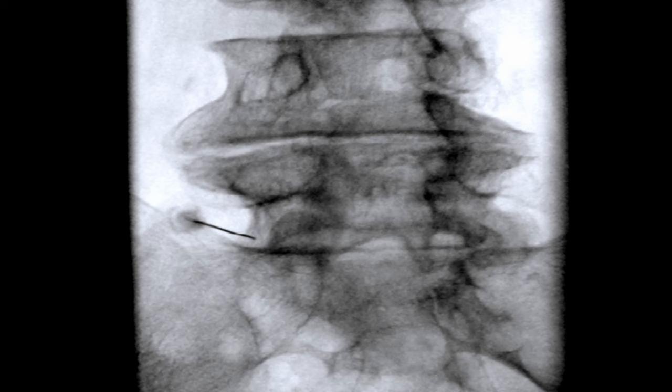It looks good, so I will infiltrate the steroid mixture. I usually use botulinum toxin in discogenic pain — at this time, I use 50 units of Botox in total. Then I will move on to the right L5 infranural approach. When there is foraminal stenosis, I prefer the infranural approach over the subpedicular one, because the contrast spreads to the foraminal space and remains more concentrated there. Enjoy the show!